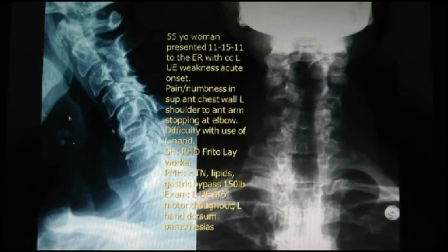And just on this x-ray right now, can you make a little story for us, why C4-5 developed spondylolisthesis? Because of the anterior osteophytes at 5-6, 6-7, they are more rigid, more fused. So she's got to move somewhere. So she moved at 4-5. So it's the first mobile segment above a relatively stiff area.